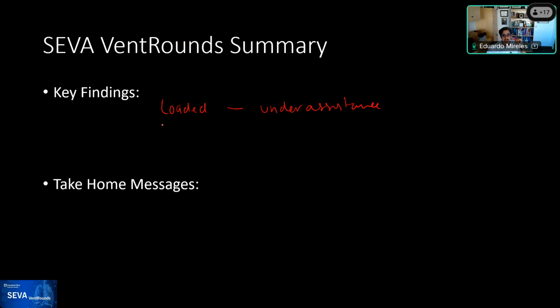We talked about active expiration during inspiration, and how that's another type of loaded activity in which the patient is exhaling against a closed valve, and the closed valve is not letting the patient exhale, and then it opens and allows the patient to exhale. So in a sense, it's creating a breathing against closed environment.